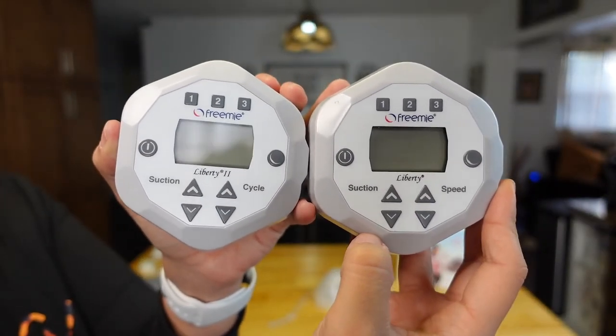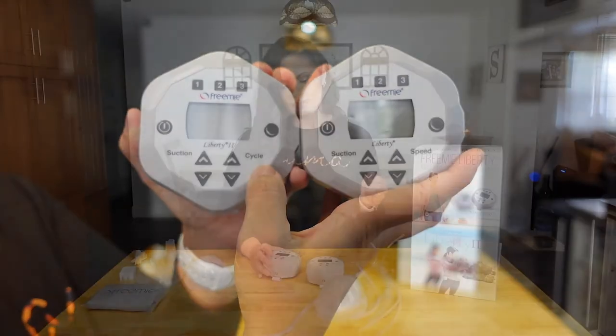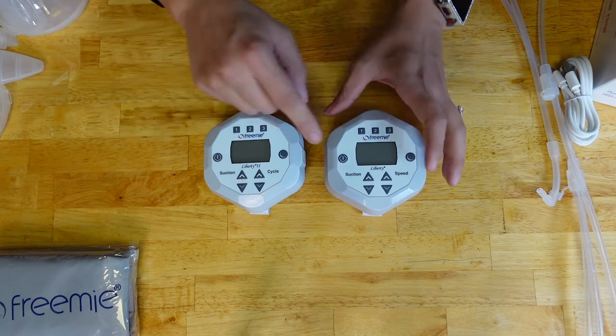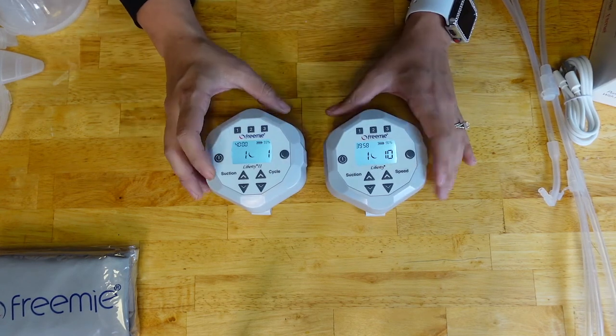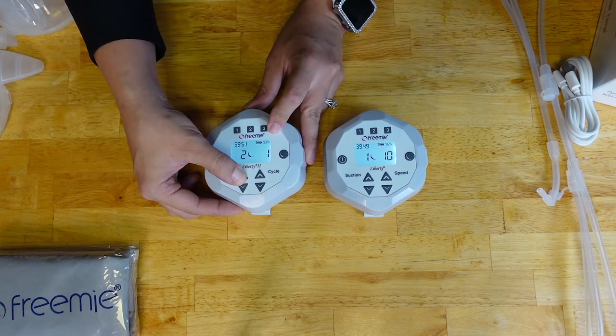Another thing that has changed are the options on the bottom. On the Liberty 1 you could choose suction and speed. On the Liberty 2, you choose suction and cycle. What's the difference? When a baby breastfeeds, they do a vibration motion on the breast that signals the breast to do a letdown and create more milk. With the cycle setting, you can mimic how often that happens. With speed, you were only speeding up or slowing down the suction. Both pumps go in increments of 1 to 10 on each side.